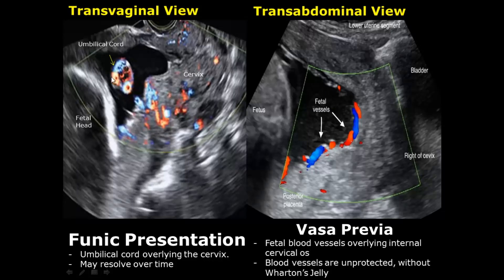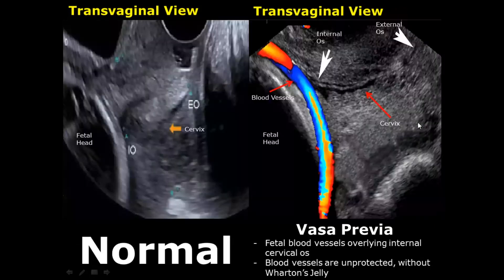This funic presentation may resolve over time. Whereas in vasa previa, we do not see any part of the umbilical cord floating in the amniotic fluid. Here is a transvaginal view showing a normal image and a vasa previa — there are fetal blood vessels overlying the internal cervical os, whereas in the normal image there will be no fetal blood vessels present there.